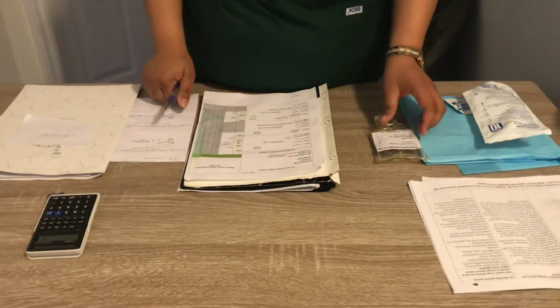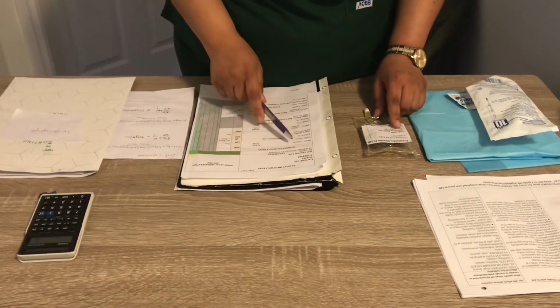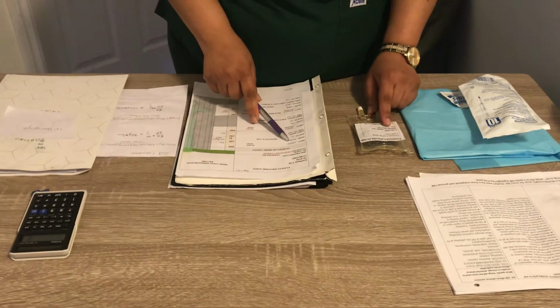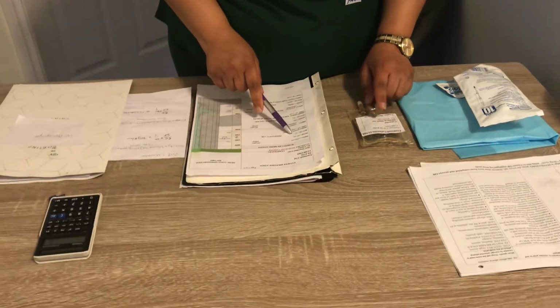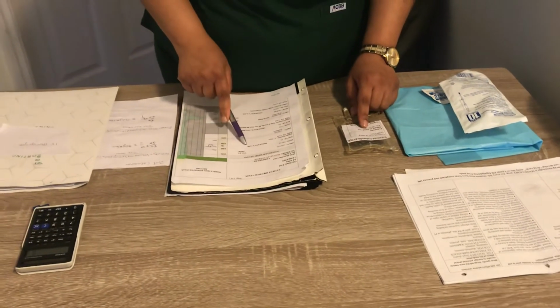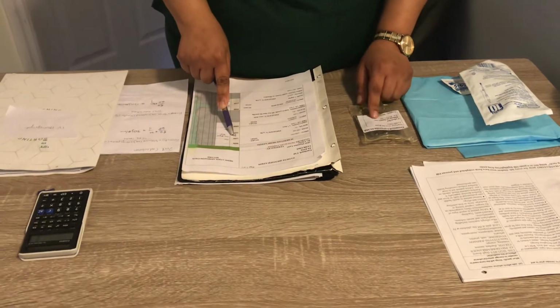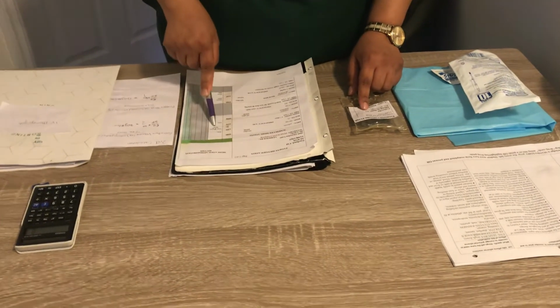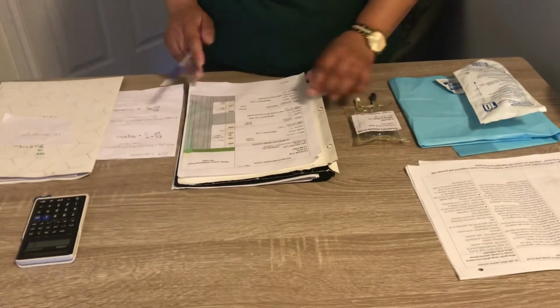Right away, I'm going to do my second check. Mr. Garland. Medication is cefazolin. The dose is 500 milligrams. The route is IV. The frequency is every 8 hours. I'm giving the 1400 medication. The site is going to be at the patient's right arm, and the reason is for post-op infection.